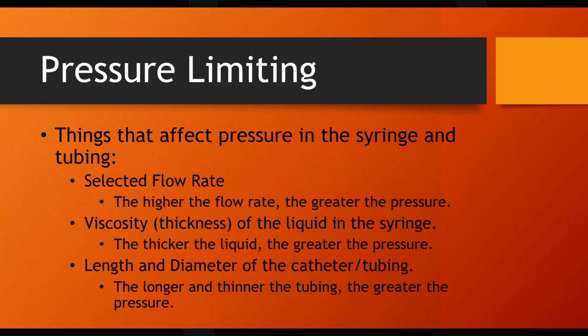I wish I had one. It's literally a stupid little plastic sleeve with just one little wire hanging out of it that plugs into the injector head to power it. It looks like you got it out of a big Cracker Jack box, like a toy, right? It's $1,300 for that stupid thing, non-repairable. When the little red light on it goes off, that means it doesn't work anymore. You just throw it away and buy a new one. They last several years, but they're freakishly expensive.